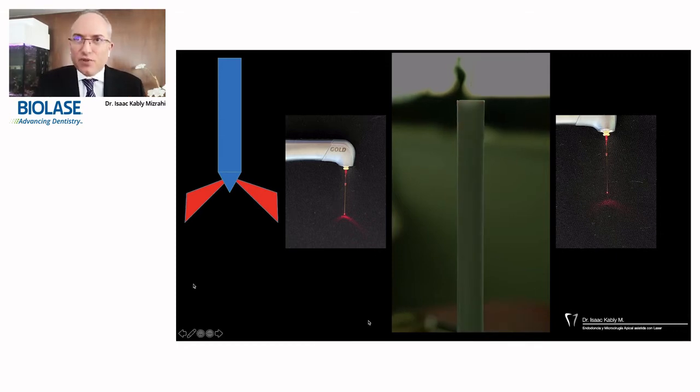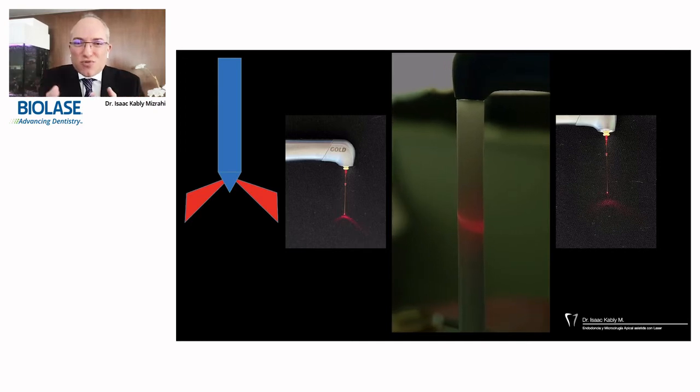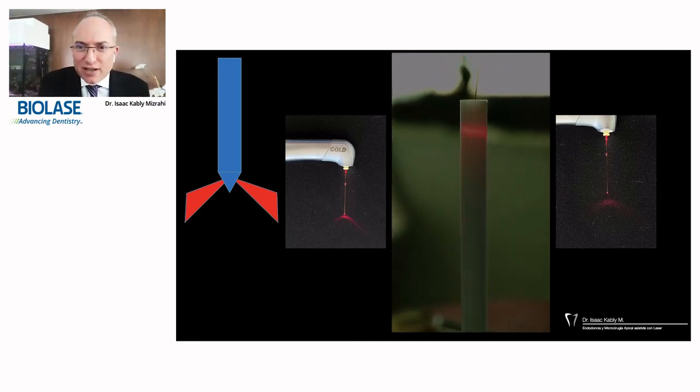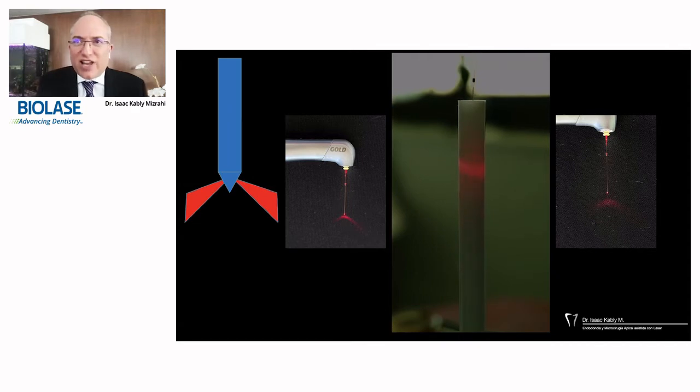You will see, the light is not projected apically. And see how when we touch the walls of the plastic tube, the energy is being delivered on each part. The absorption of that energy is happening in that exact point we touch. You will see it in a second. And some transmission and scattering is happening there too, as well as some reflection.